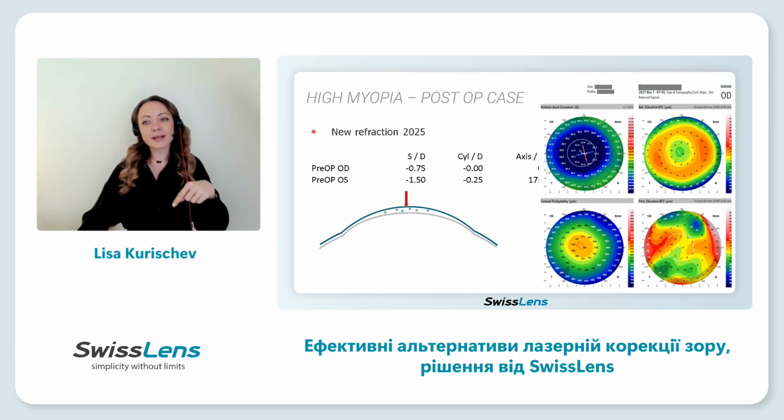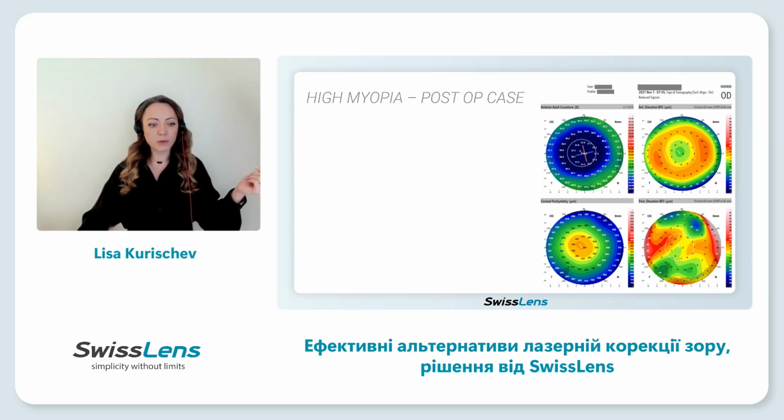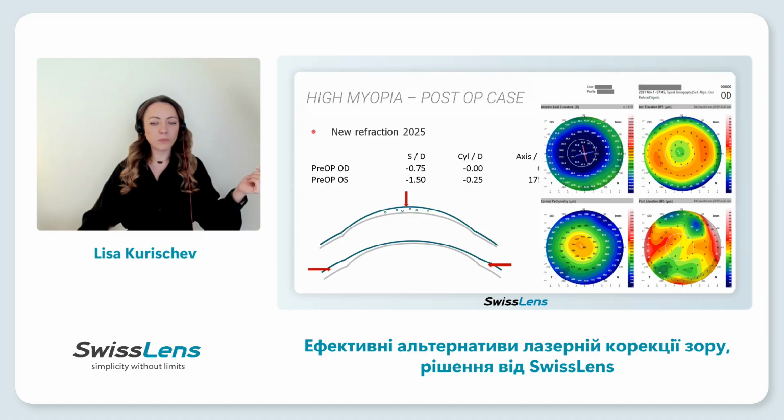But choosing a standard lens according to the center will give us a big clearance at the periphery. So the lens moves too much and it's uncomfortable. Patient cannot wear it.